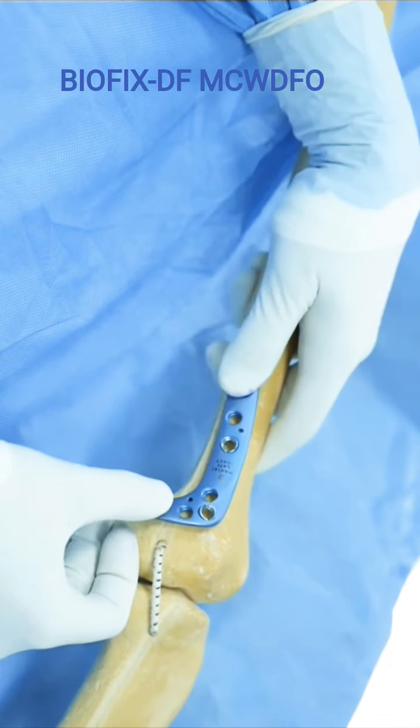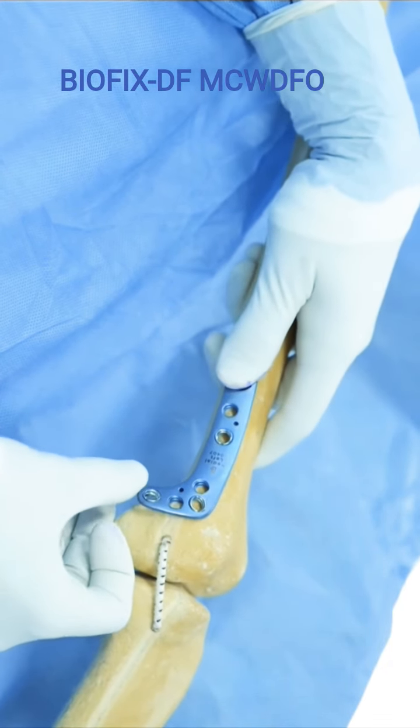So this is sort of how the plate sits. We will see when we are performing the osteotomy in the cadaver itself as to how to place this correctly.